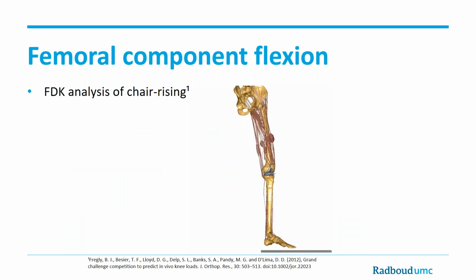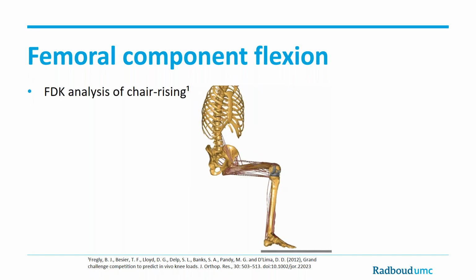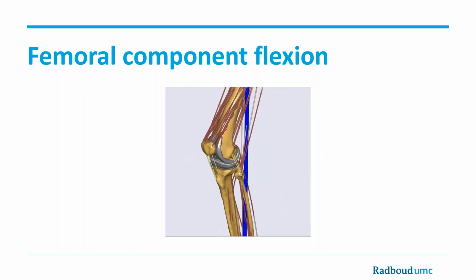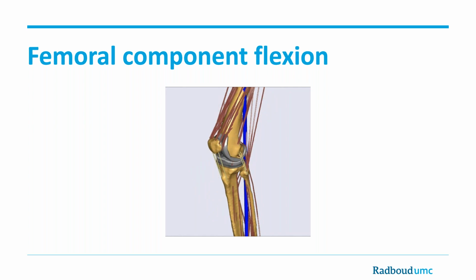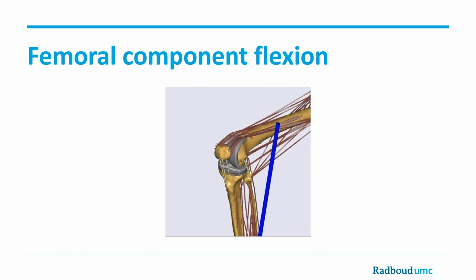We simulated another demanding task for patients wearing a prosthesis, namely rising from a chair, from the same data sets. And this gives you a close-up on the actual simulation of the knee joint during rising from a chair. Also in this case, we basically changed the alignment of the prosthesis so as to simulate different degrees of flexion and size.